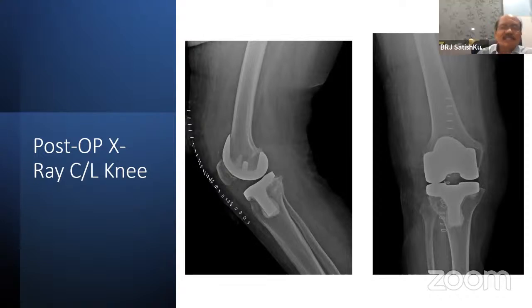As I always say, if you're doing a lateral approach, you should not worry about it. The purpose is to do the job as best as possible. So you can do a quadriceps snip. You can see the tibia very well, and the femur very well. Then you do that, because it is only a muscle thing. It is going to heal in 3 to 6 weeks. Our idea is this knee has to work for 25 years, so you do not bother about 3 to 6 weeks.